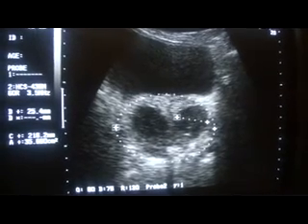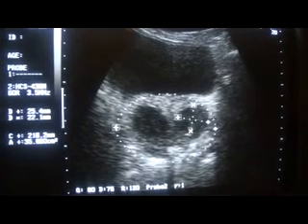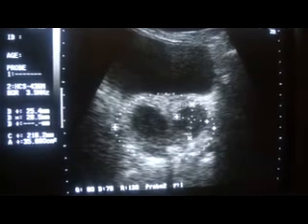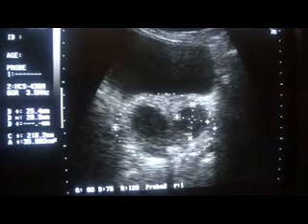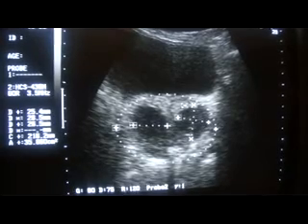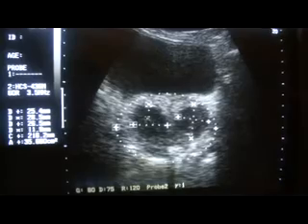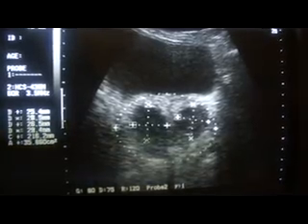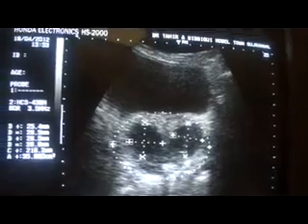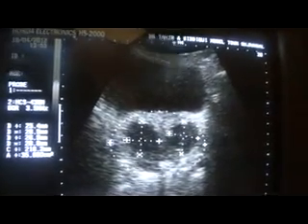So keeping the history and the appearance of the focal lesions in both lobes of the prostate in transverse section, it can be a prostatic abscess, one possibility. Now let's study it in longitudinal section. This was the transverse, and this is the longitudinal section.